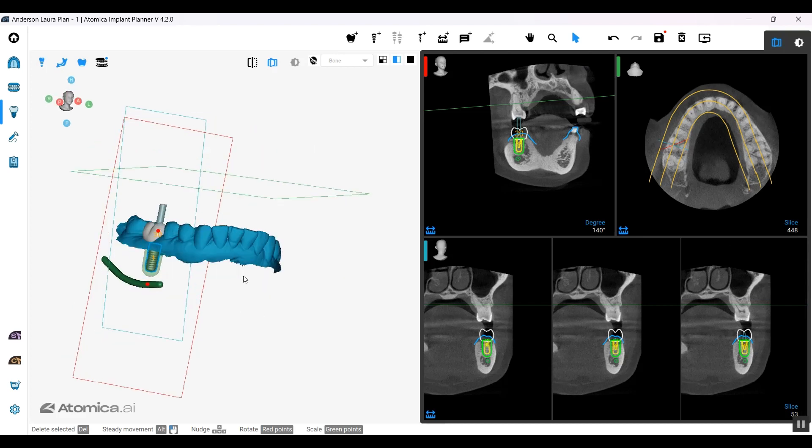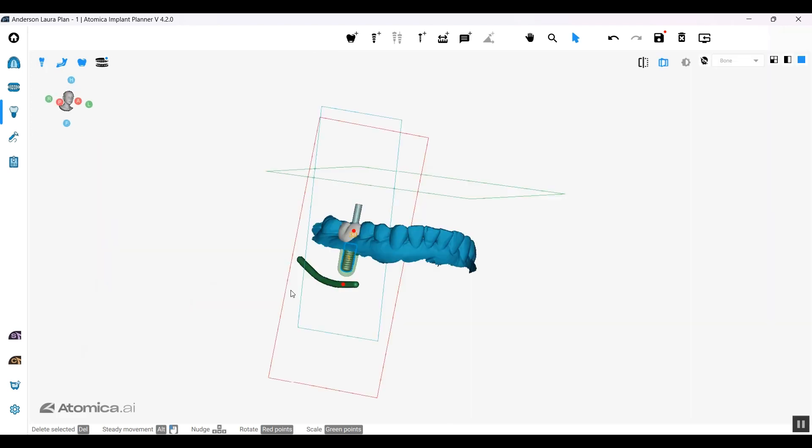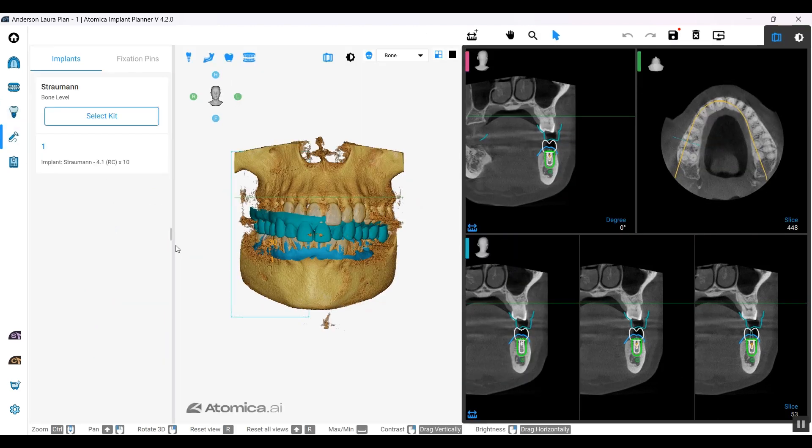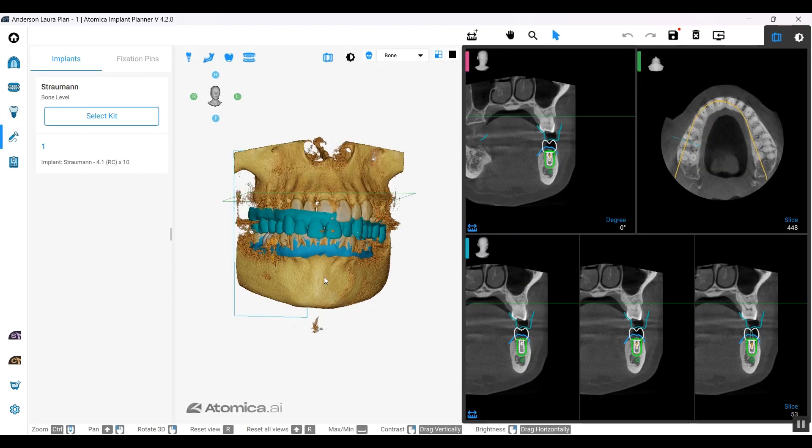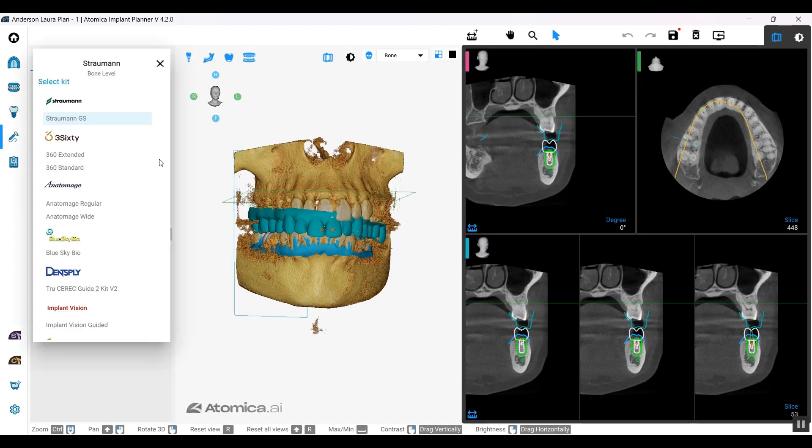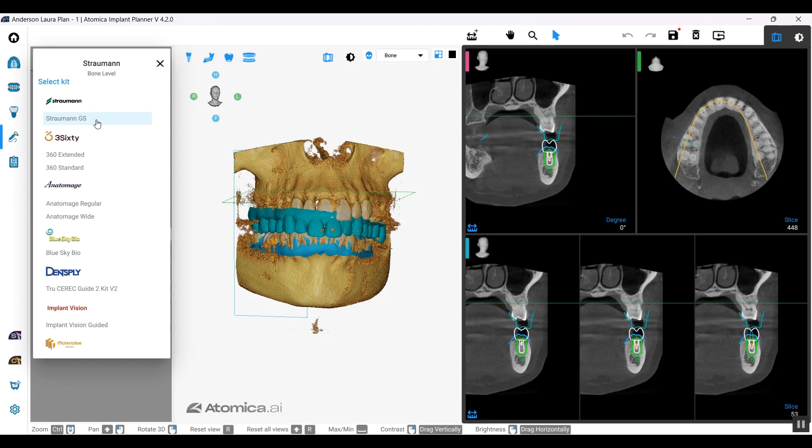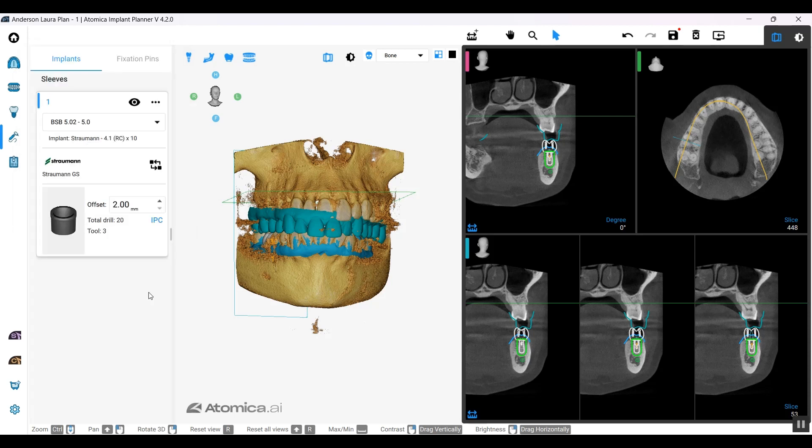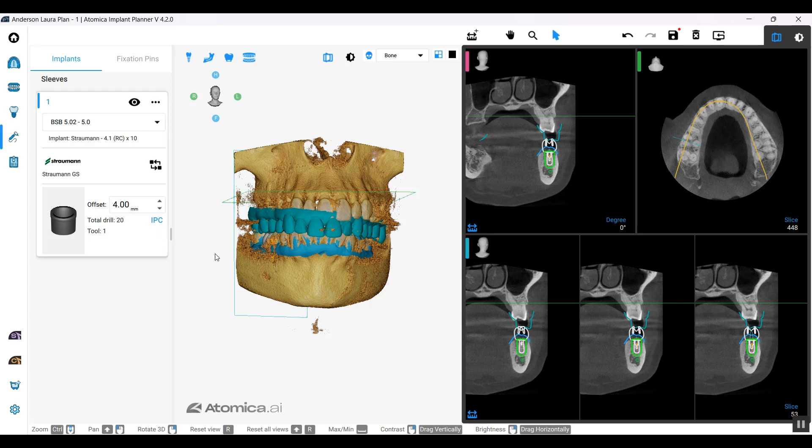After we added our implant, we're going to add the sleeve to it. Once I select the sleeve, the very first option that comes up is the sleeve compatible with the system I just selected in the first place. I selected Straumann bone level, so of course the sleeve compatible with it is the Straumann GS, and these are the different offsets available by Straumann.